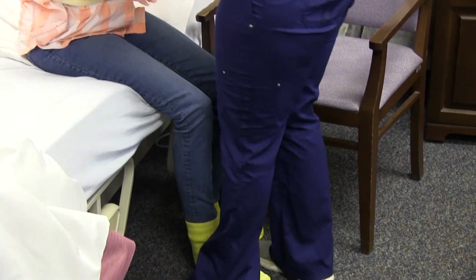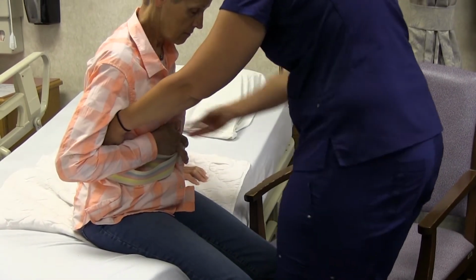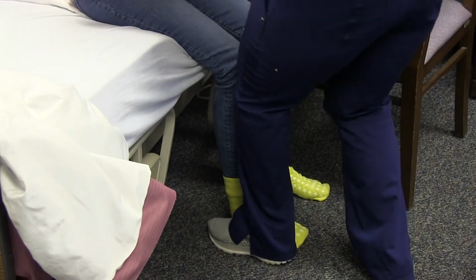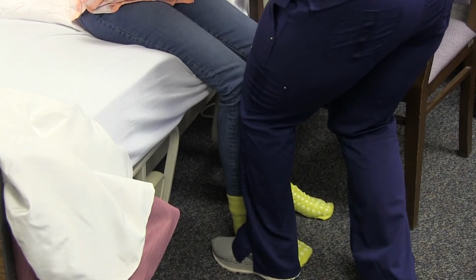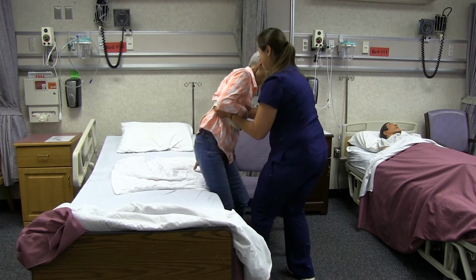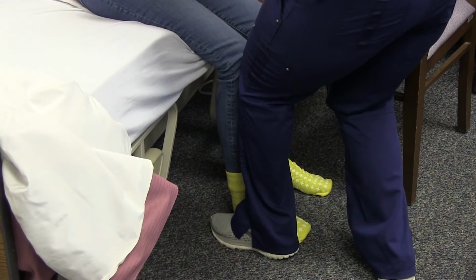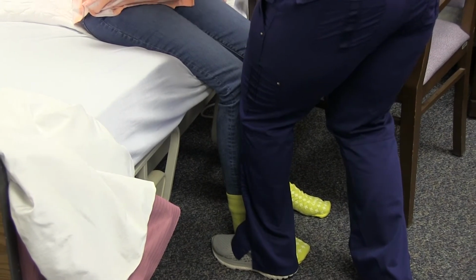Assist client to edge of bed, feet on floor, and strong leg forward. Moves pivot foot back 6 to 12 inches, foot closest to chair. Flexes own hips and knees to align with client's knees. Places arms around client and grasps gait belt firmly from underneath along client's sides. On count of 3, instruct client to stand while straightening hips and legs, keeping knees slightly flexed. Make sure your body weight is moving in the same direction.